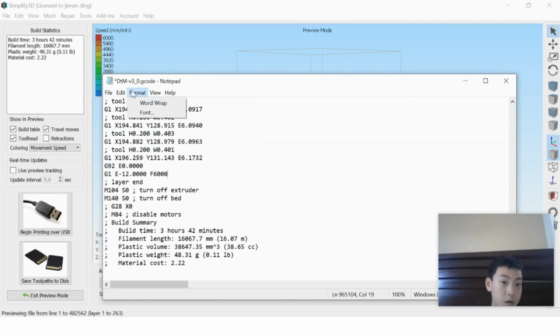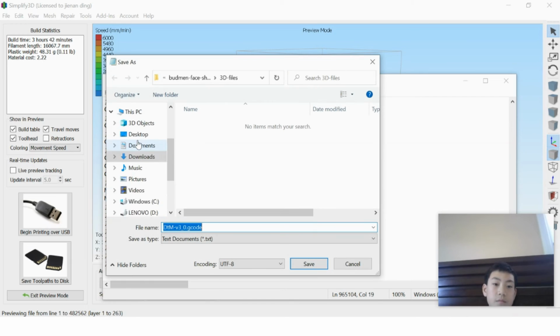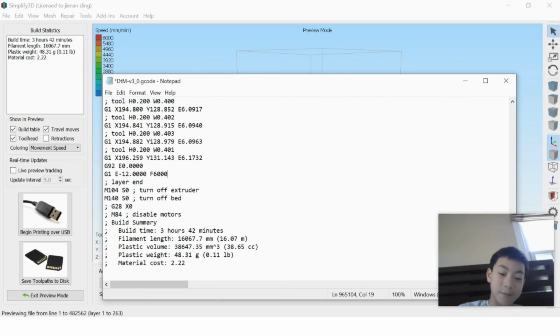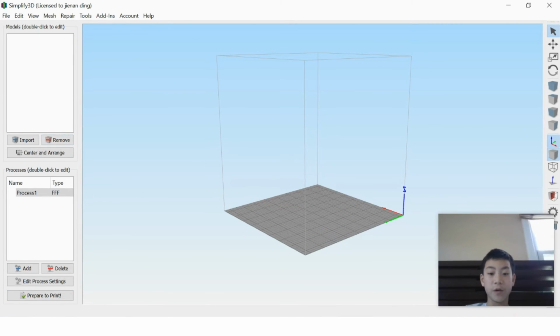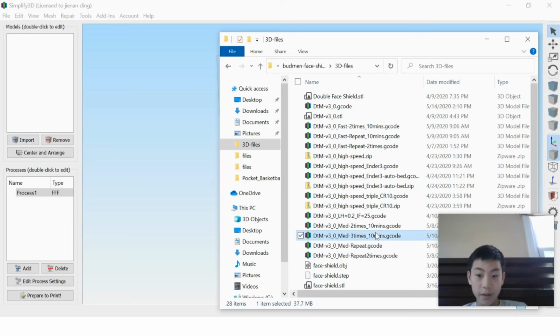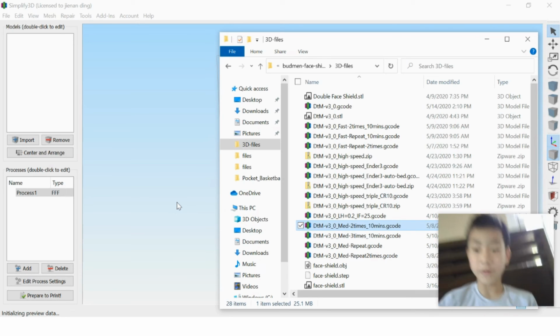Next, to get ready for it to print, you will want to press Save As, and you can save it as a different G-code, which I don't want to do again because I have plenty of them already. I already have one in here. First, I want to empty Simplify 3D because I'm going to preview it in here. This one actually has 3, so I'm going to drag this in 2 times to make it easier. I drag it in, I drop it, and I wait, and it'll show me the preview.